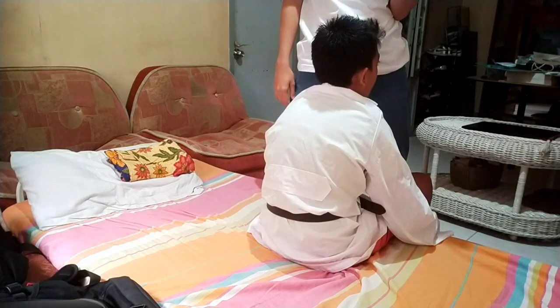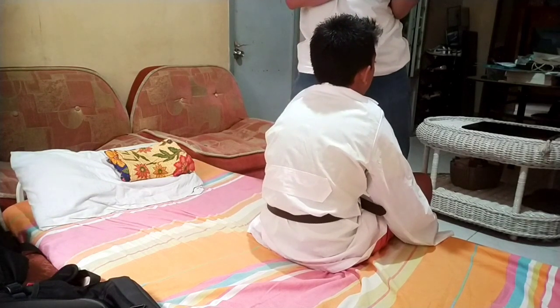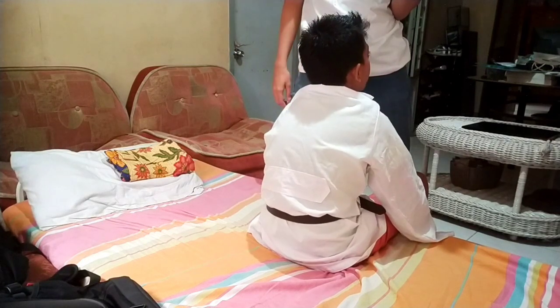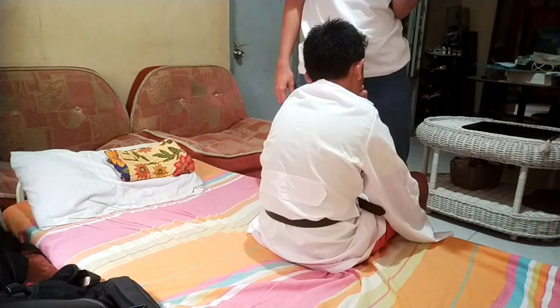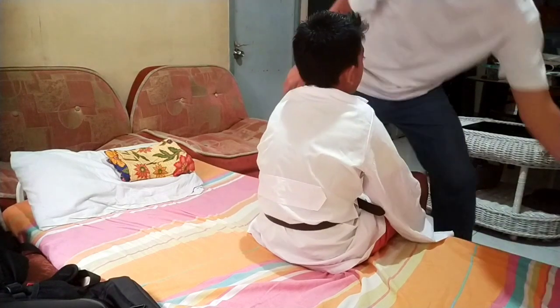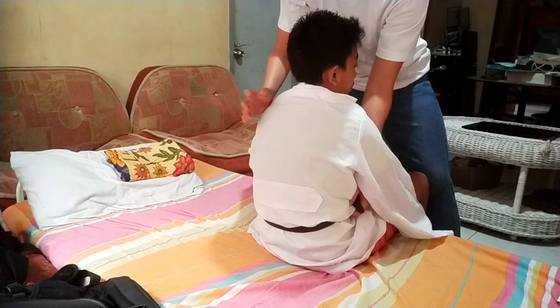Lean your trunk forward from the hips, flex your hips, knees, and ankles. Assume a broad stance, placing one foot forward and one back. Brace the client's feet with your feet to prevent the client from sliding forward or laterally. Mirror the placement of the client's feet if possible. So assume a broad stance. So just like this, or maybe like this. You can do this.